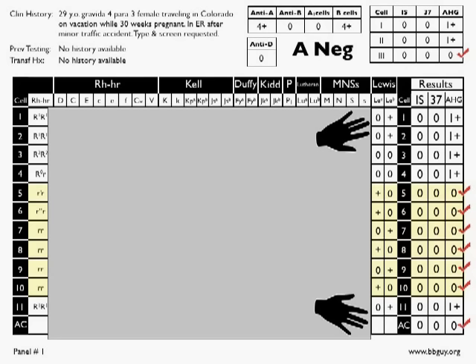I'm also going to show you, using this method and only doing one double dose rule out for each antigen before I stop looking at that antigen. Let me explain what I mean. So we start with cell 5, which obviously is the first completely negative cell for Lewis A and Lewis B. So we look at Lewis A and Lewis B in cell 5, and obviously, as you see, we have a double dose rule out for Lewis A. We put a single slash there, and we're done. I don't need to look at Lewis A again in the rest of this panel.